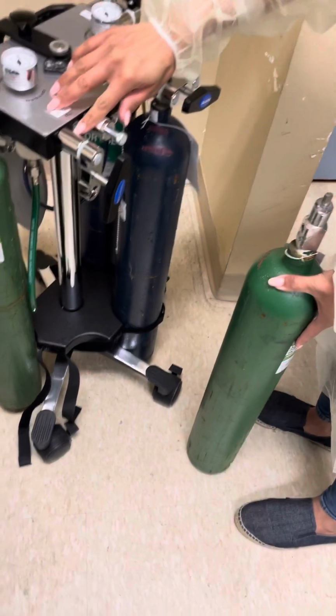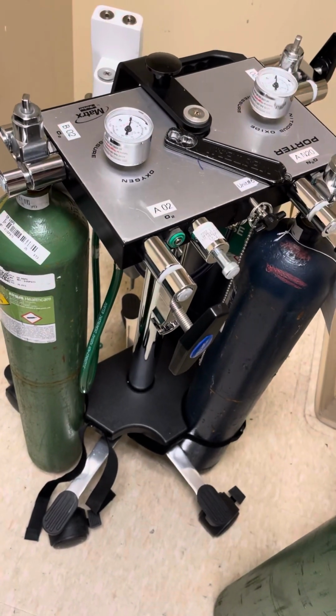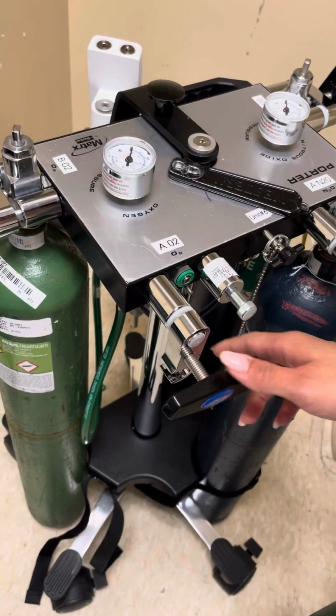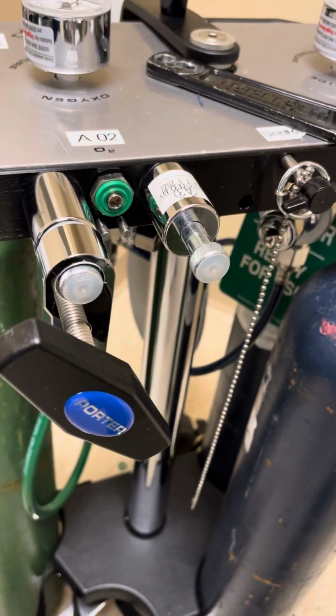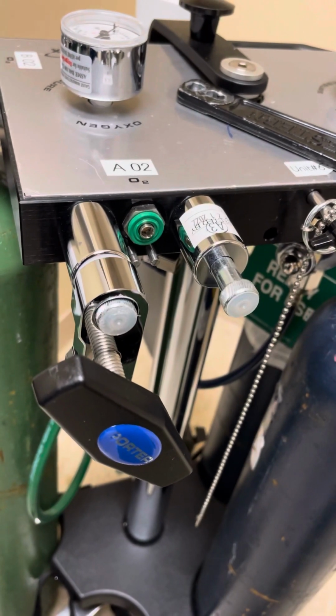This also needs a gasket, so make sure they have gaskets on here. As soon as you take that green tab off, the gasket's already on there, but just make sure there's a gasket. And these little pins line up. So it will not let you put a nitrous tank on an oxygen tank or oxygen on nitrous because the pins are arranged differently, okay?